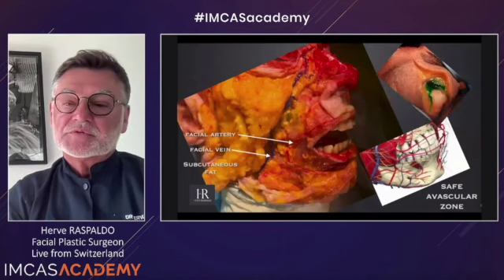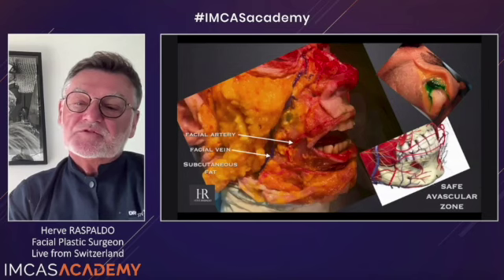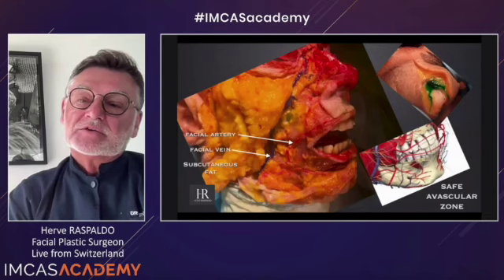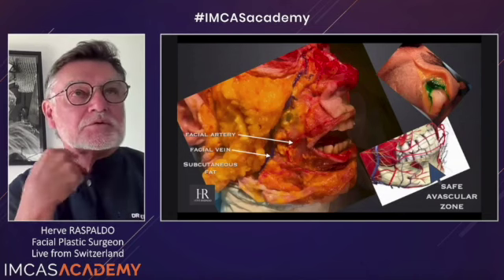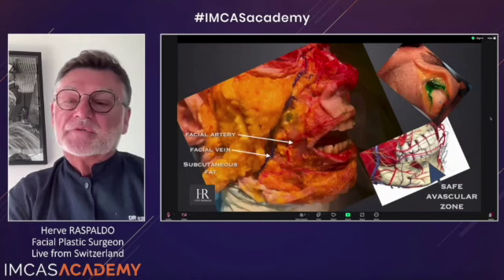So finally, what you create, you don't create a bolus, you create a pyramid. And if you look at the bone of the mandible, you see here, this is like a pyramid, okay? Why is it safe? Because you are in an avascular zone. This is the gel colored with methylene blue. You inject down to the bone. Here is the mentalis muscle. And all the vessels, they come from lateral. Forget this submental artery. They are never on the bone. There is not a hole, nothing.